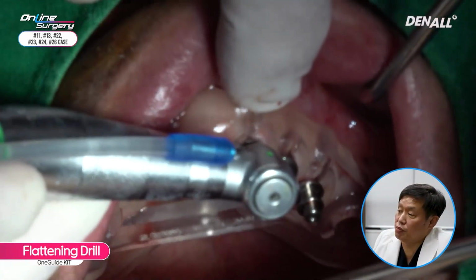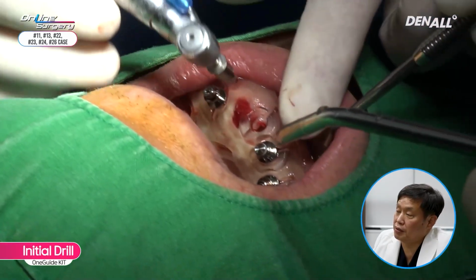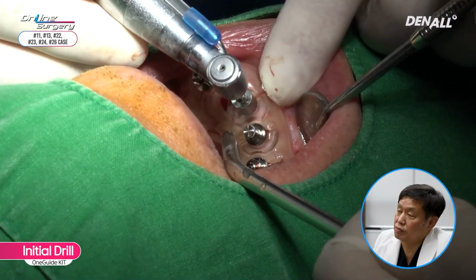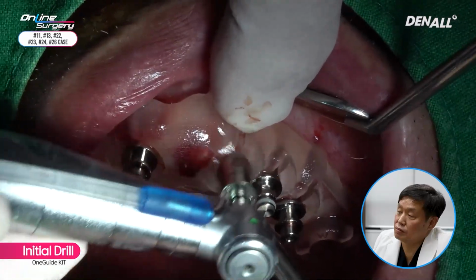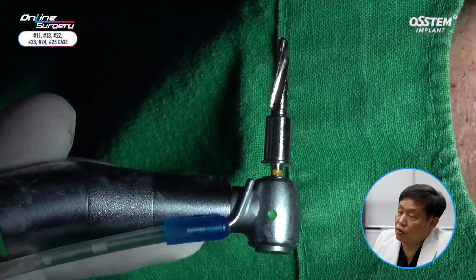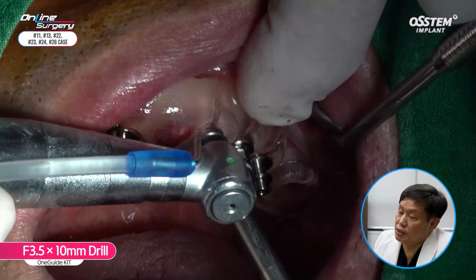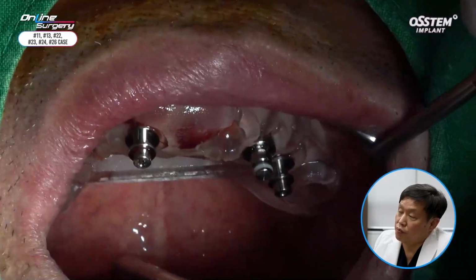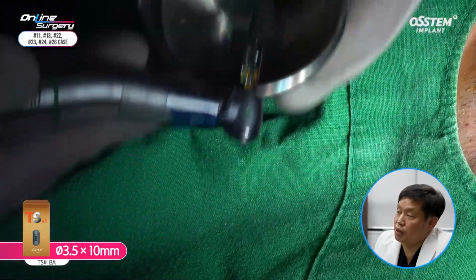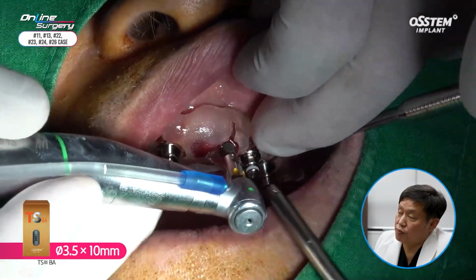Number 22. As was done earlier, flattening drill was used, followed by initial drilling. Initial drilling was done. The bone was fairly favorable. 3.5 by 10 mm OneGuide drill was used. TS3 3.5 by 10 millimeter BA surface implant was placed. In number 22, the diameter was 3.5.